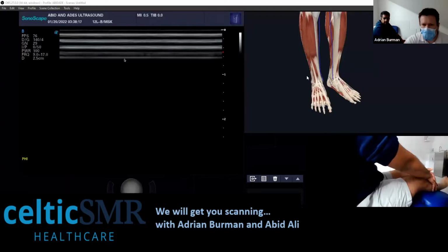Going to be general inquiries. So if you've been watching our videos or you've just been practicing scanning and you have any burning questions that you'd like us to run through, then this is the opportunity for that. Otherwise, we thought we'd just break the ice and just get started scanning.